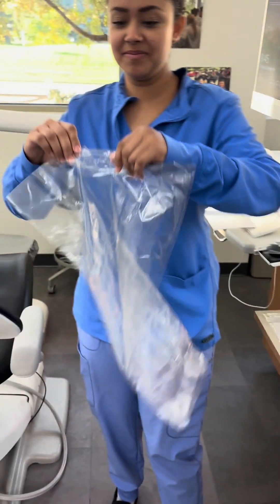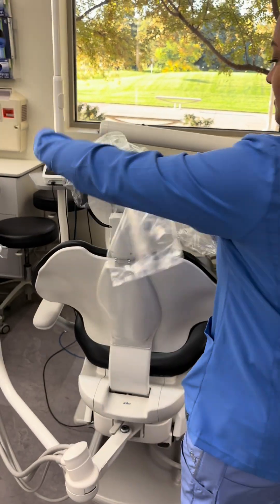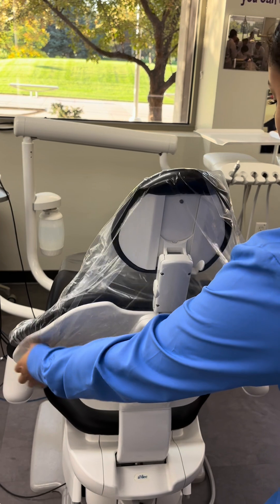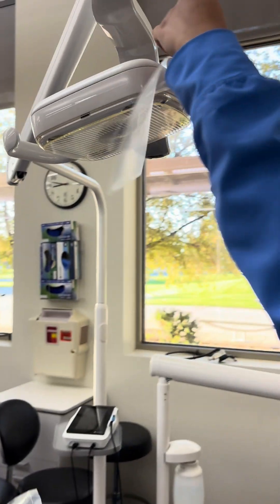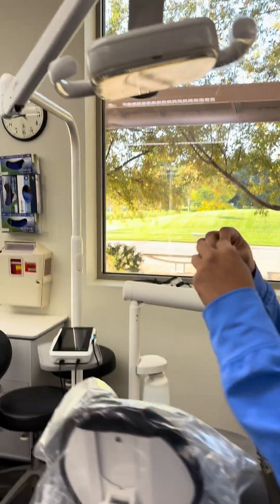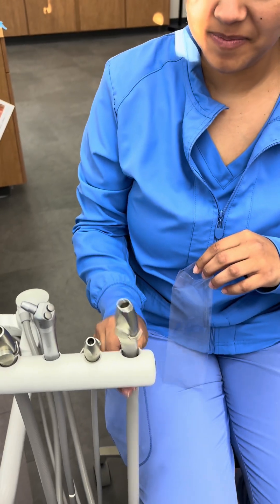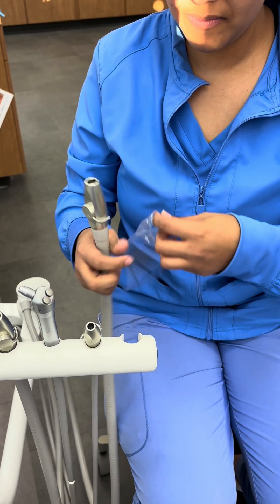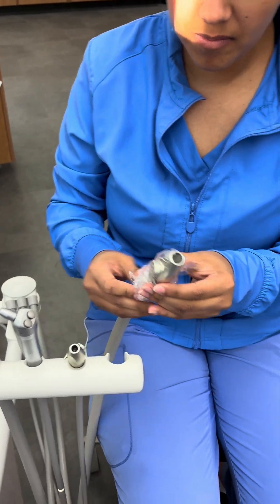She's going to start by placing her chair barrier on with her clean hands. Now she'll take some syringe sleeves and use them for both light handles for the operator and the assistant side. She's going to take these sleeves and put them on one of the high vacs, the saliva ejector, and the air-water syringe.